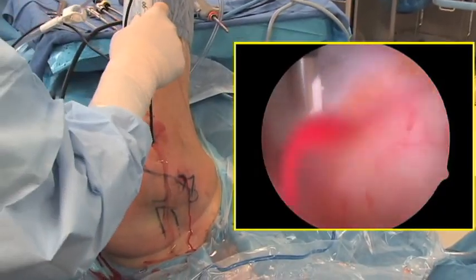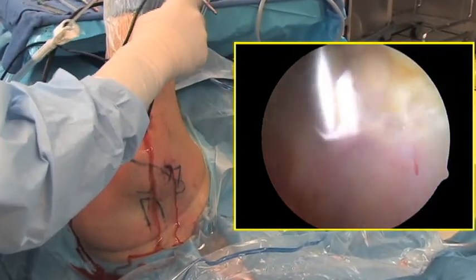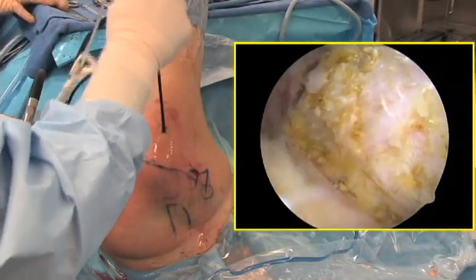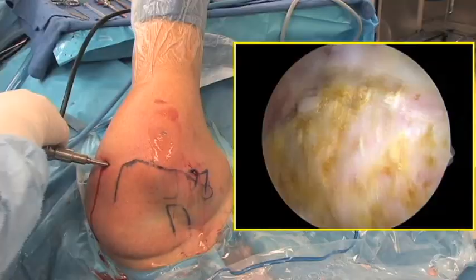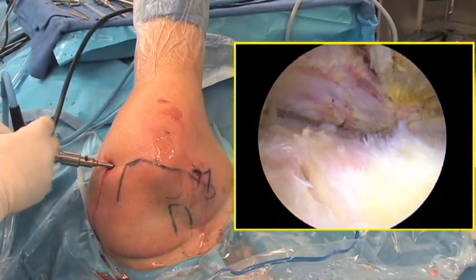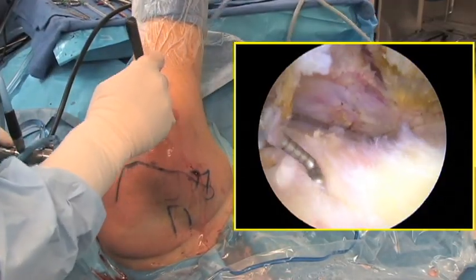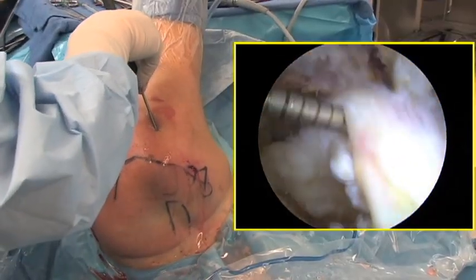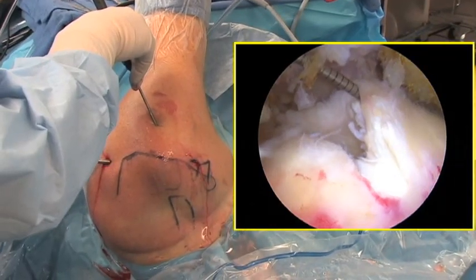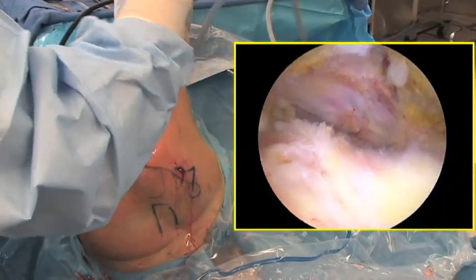A bipolar electrocautery device is used to maintain hemostasis and then to remove soft tissues from the undersurface of the acromion. If desired, the coracoacromial ligament can be detached from the anterior edge of the acromion as well. It is important to define both the lateral and anterior borders of the acromion using the bipolar cautery device. Once the bursa is removed and the undersurface of the acromion is prepared, a probe can be used to inspect the rotator cuff tear. In this case, there is a full thickness non-retracted tear of the supraspinatus tendon.